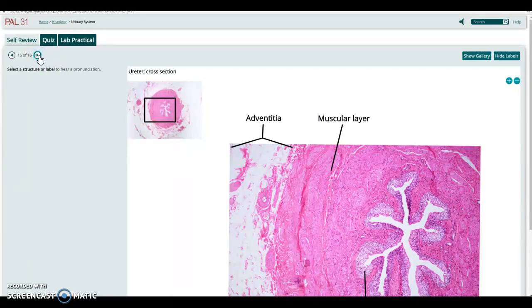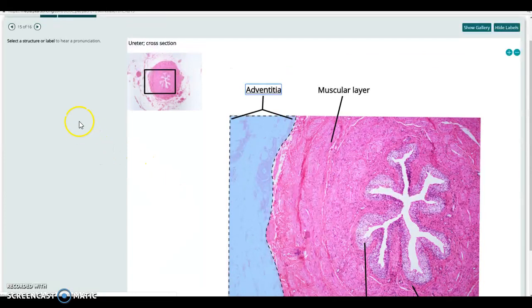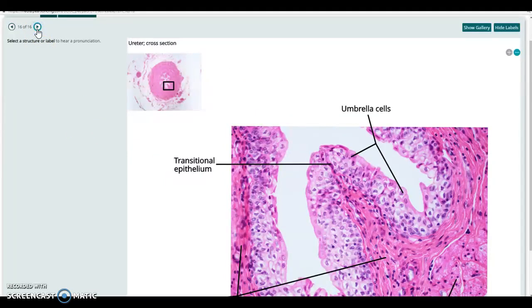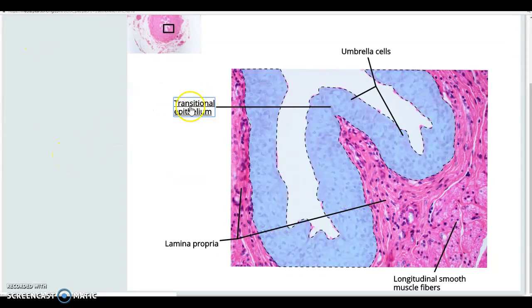There's just a slightly higher magnified version of the ureter and showing that transitional epithelium on its inner surface, just like the bladder has. And just even more up close, showing the transitional epithelial layer on the inner surface of the ureter.